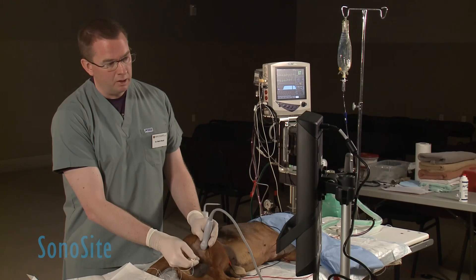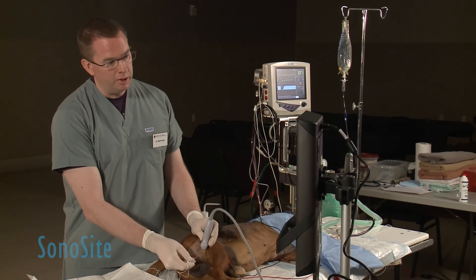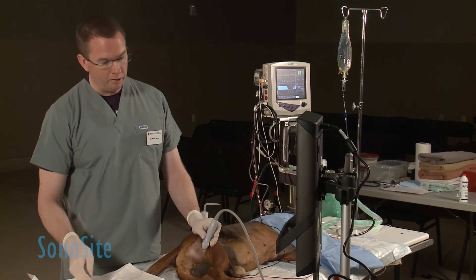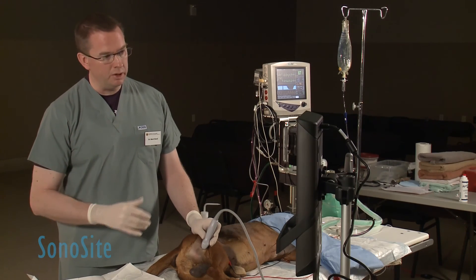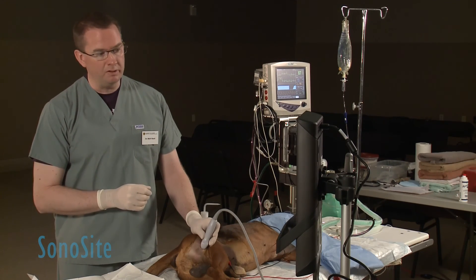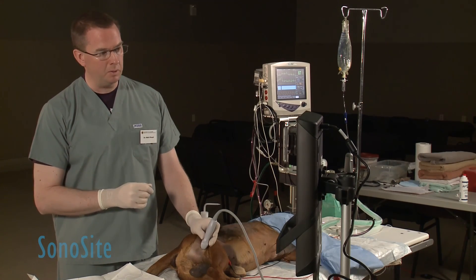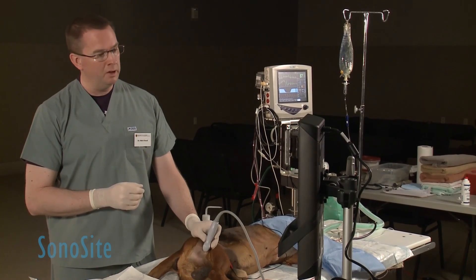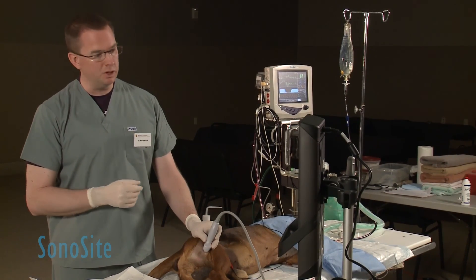When we're happy with the spread of the local anesthetic, we simply remove the needle from the patient. At this point, with a good sciatic nerve block, the patient should have a very stable anesthetic as surgery is performed distal to the point of the block — typically stifle surgeries, tarsal surgeries, or digital surgeries.